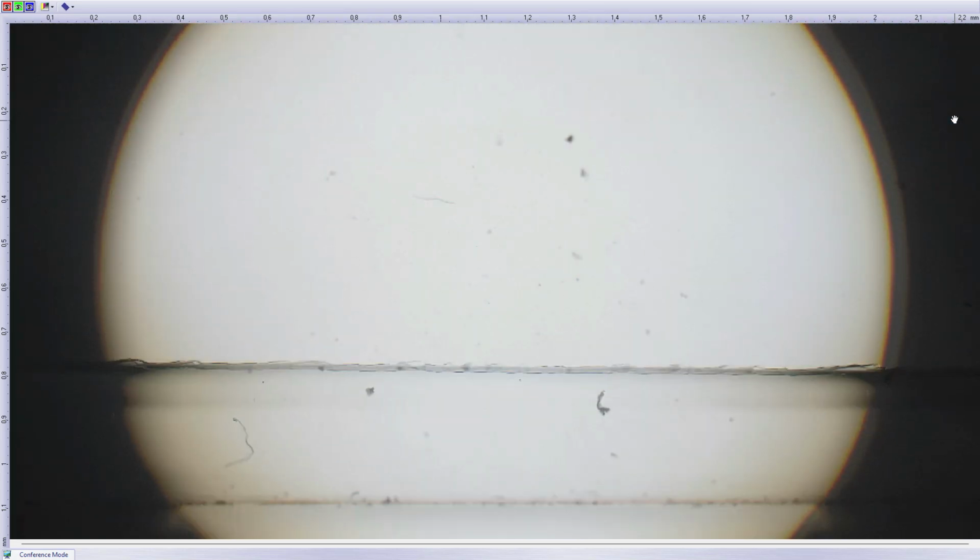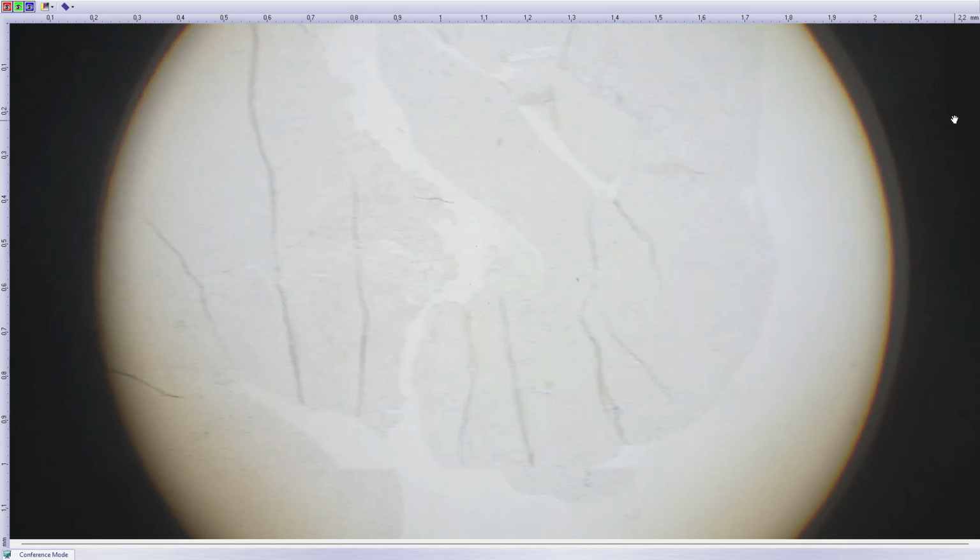Importantly, these tumors tend to have TTF1 positivity, which was described as probably the best diagnostic marker of SEGA.